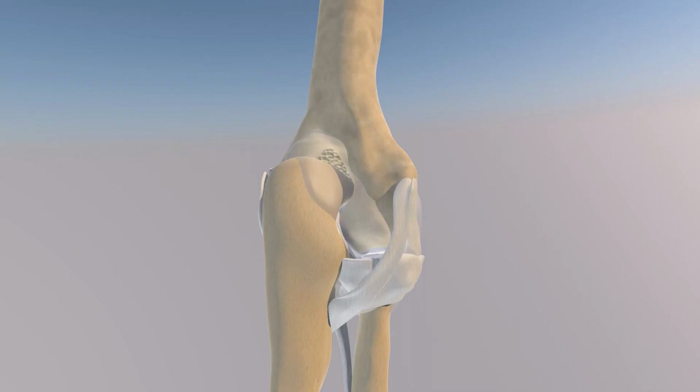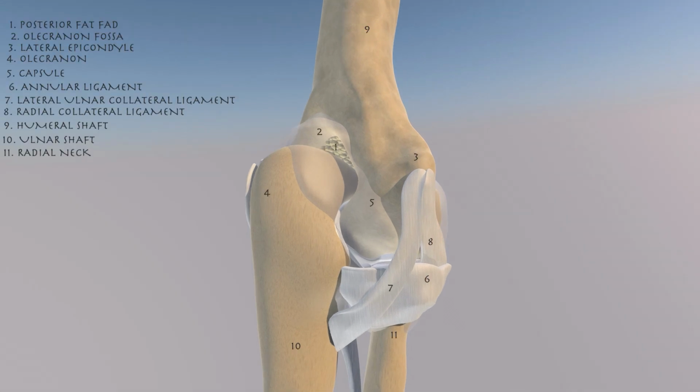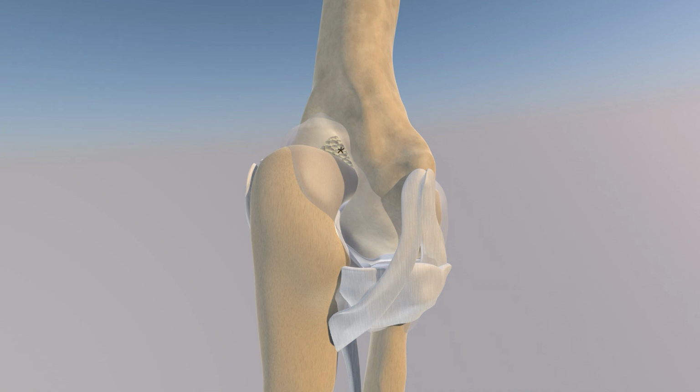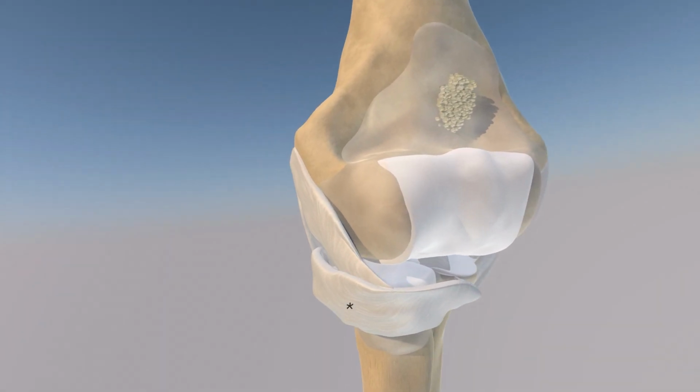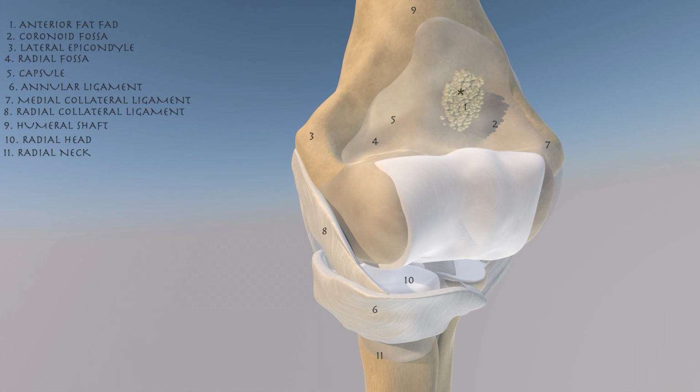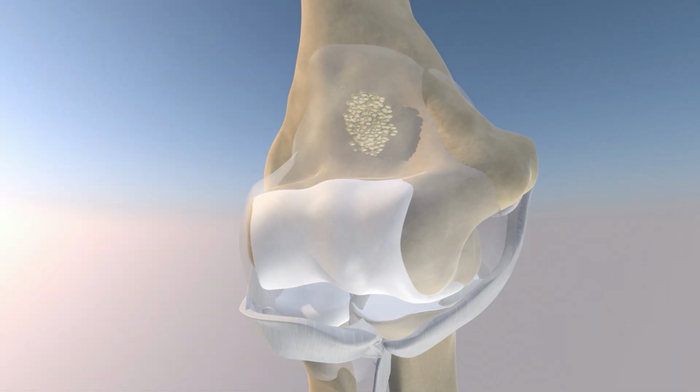Here we're going to go over some basic elbow anatomy, just not including the musculature. We can see the capsule, we can see the posterior fat pad in the olecranon fossa. And now we're rotating, we can see the radial collateral ligament, the annular ligament. You can see the anterior fat pad, and appreciate the hyaline cartilage over the capitellum and the trochlea.